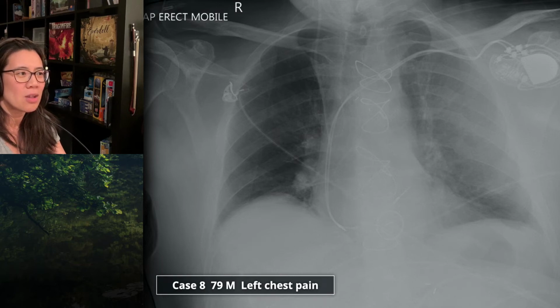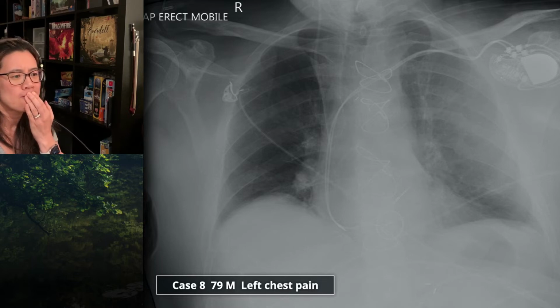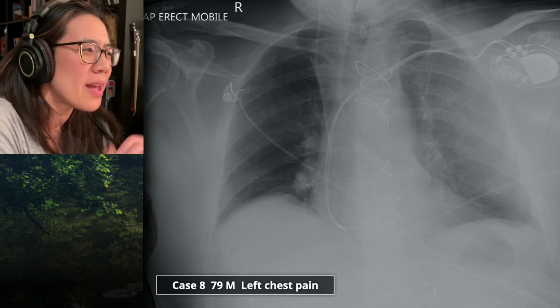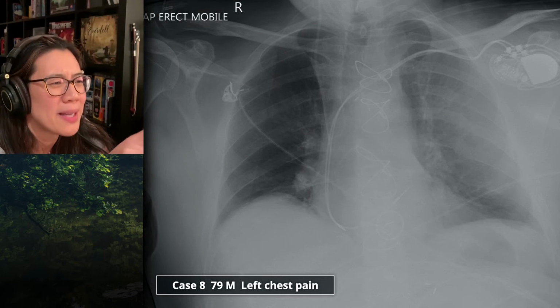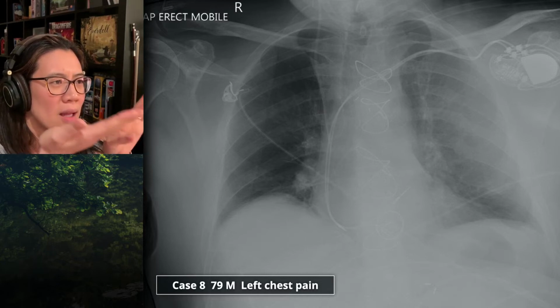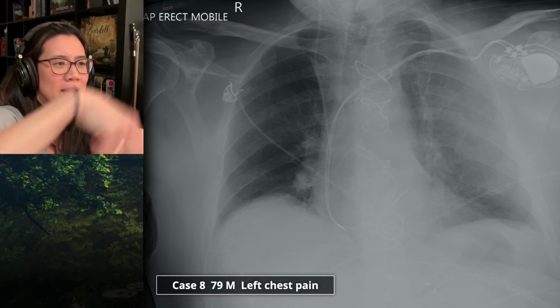Okay, hold on. So then, assuming that the asymmetric density is real, is this a large chest wall hematoma or something in front of the chest related to the pacemaker? Now, you said the pacemaker leads were intact. Well, as in they're not, you know how they break and get disconnected? That's what I mean by intact. So that pacemaker is not how I would normally see it. Initially I thought it was projectional, that maybe the patient's lying funny. But usually when you look at pacemakers, you can see the electronics on the film, whereas I'm not seeing them. And you normally can trace the leads down into the pacemaker proper, and I can't.